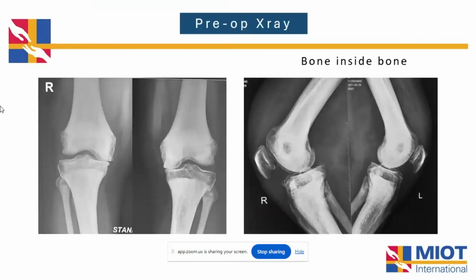On the tibial side, the epiphysis is spared, mainly on the left side, but below the epiphyseal scar it is more sclerotic. And the femur doesn't look like that; even the epiphyseal area is sclerotic.